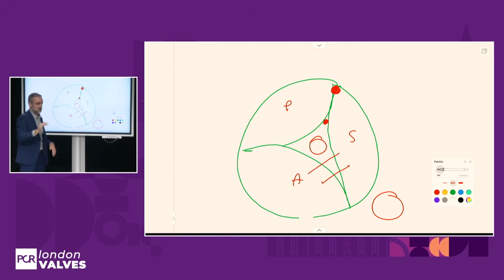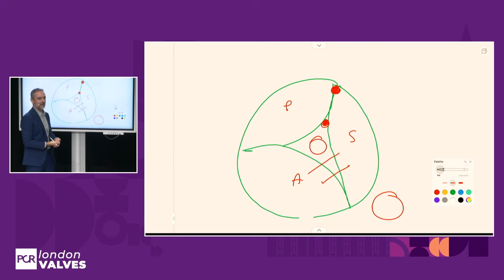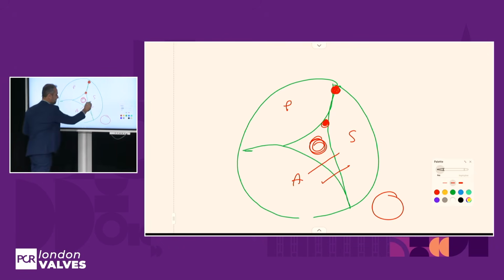But sometimes, like in the first case, in the simulator, something here looks like it's interfering with the septal, and sometimes with the posterior leaflet, or the third case is kind of in the middle and we don't know. When I was talking about the standard zipping, that would be the Clover.